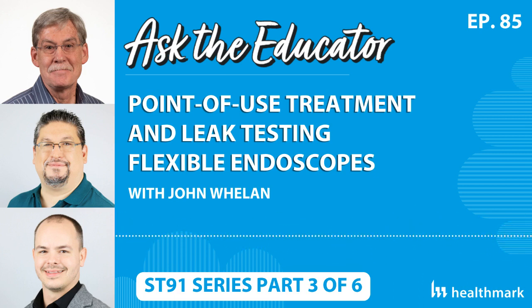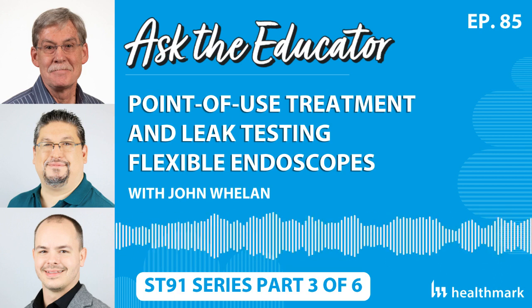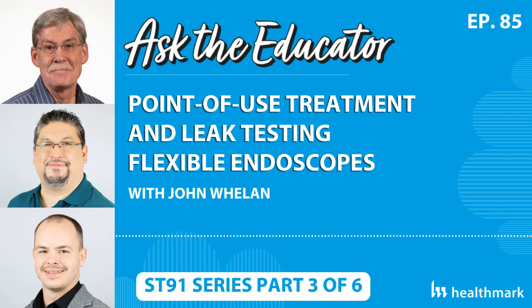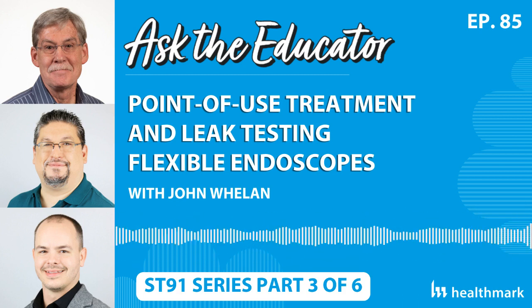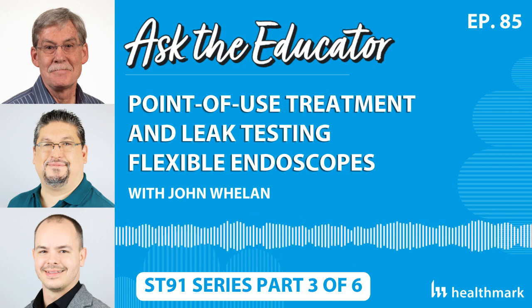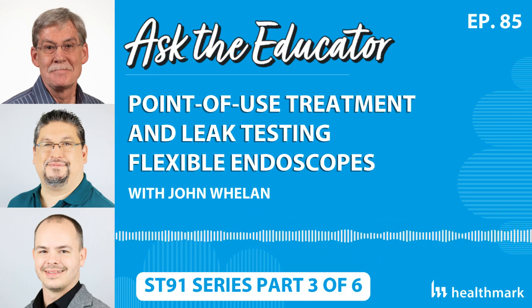Yeah, so let's get into the communication part of the handoff, because I like the change, right? It's not just pre-cleaning, that's a part of it, but there's a lot of point of use things that need to get done. So point of use treatment's actually a better terminology to encompass all those things. But talk a little bit about that communication, that handoff between the endoscopy room and then moving into the decontamination area. Right. So historically, it did not routinely exist.